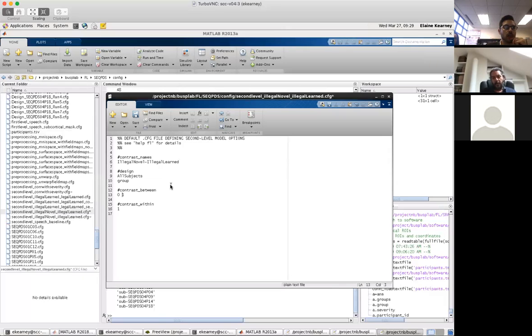Then you can also do additional analysis, and this is where severity may come in. I mean, you might say, well, perhaps the difference between the two groups is actually correlated with severity, and you might want to look at whether, within that region, you have any correlation between the activation, the response, and severity of the illness, or you might actually try to control for that difference, controlling by severity.